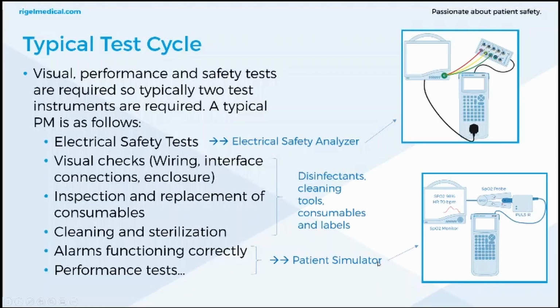Patient monitors are also regularly tested in situ. This is why multi-parameter patient simulators are often preferred in the field. So the image shows how PM could effectively be carried out using two portable instruments, alongside a couple of other tools such as labels, cleaning products, etc.